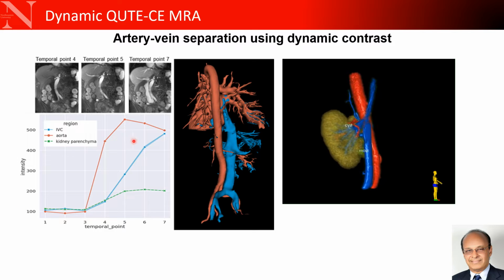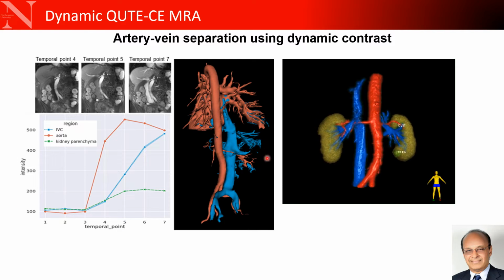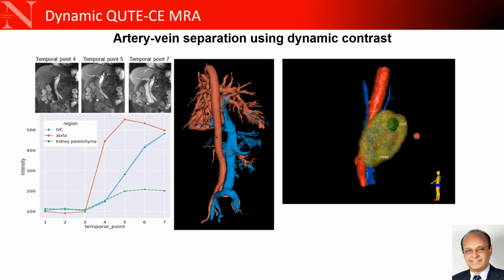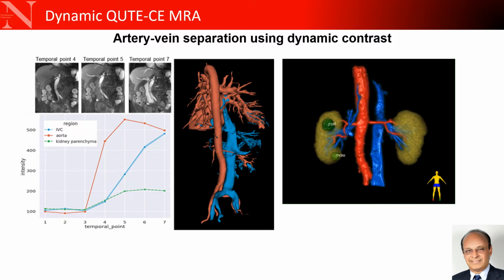This dynamic scanning enables us to separate out arteries and veins. In the subsequent steady state, all the vessels are equally bright.